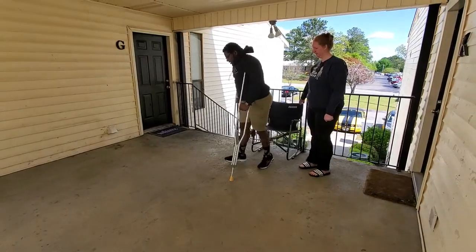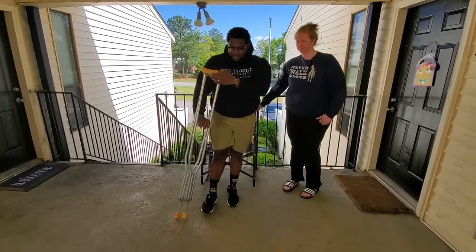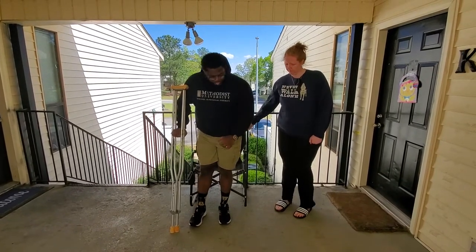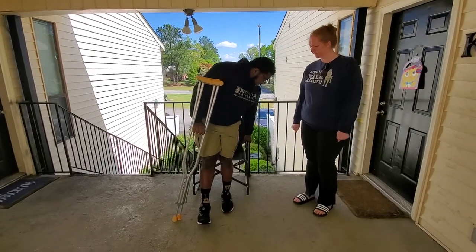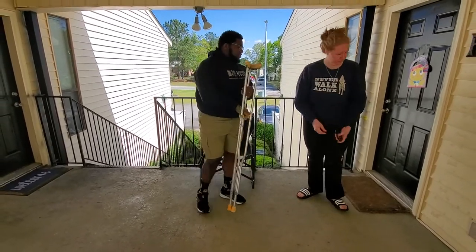Now it's sitting down, which is very similar to getting up. You're going to put the crutches on the side you had surgery on, make sure your feet are as close to the chair as possible, lean back, putting your weight on the chair through the crutches, and just sit down.